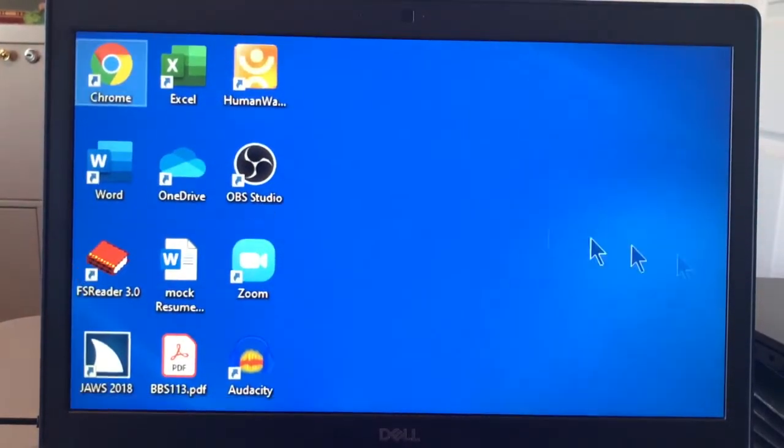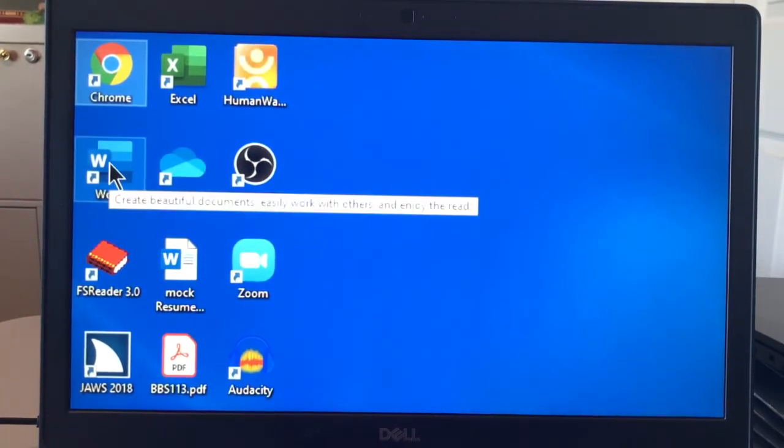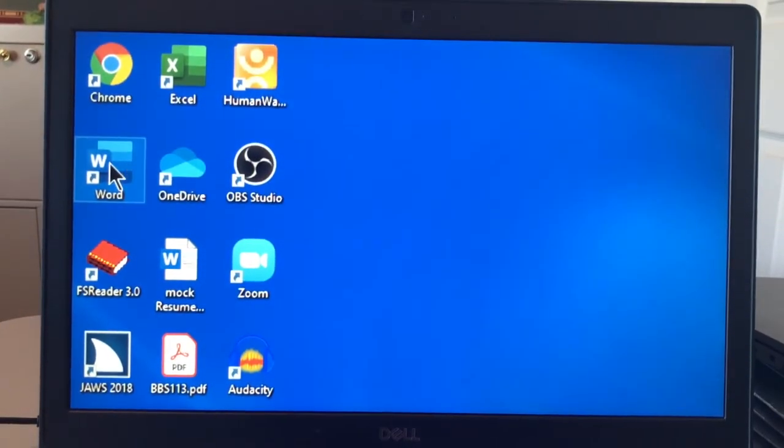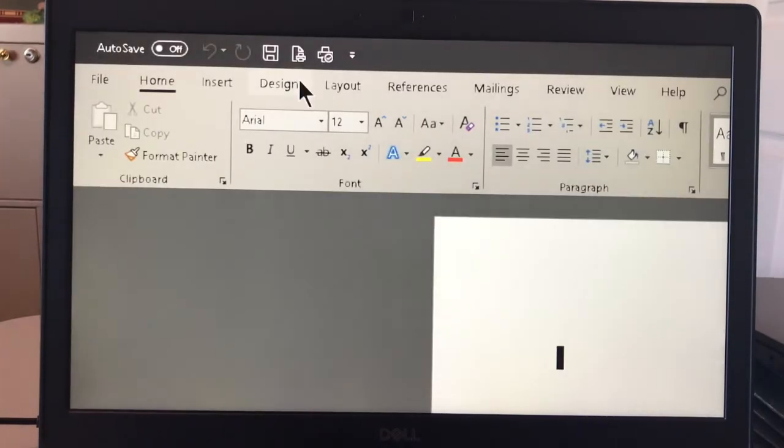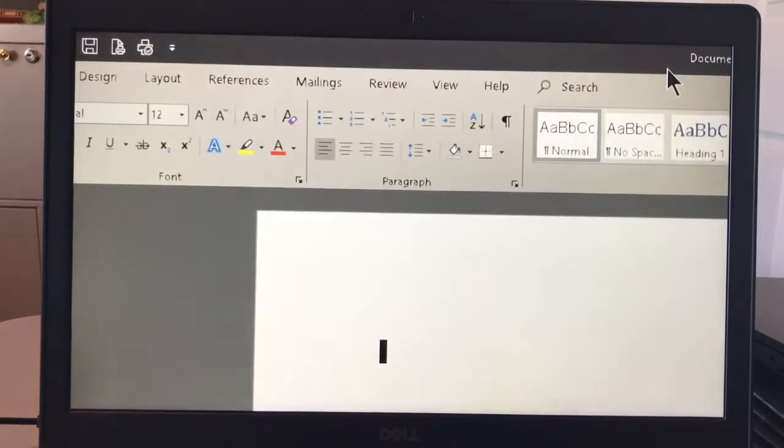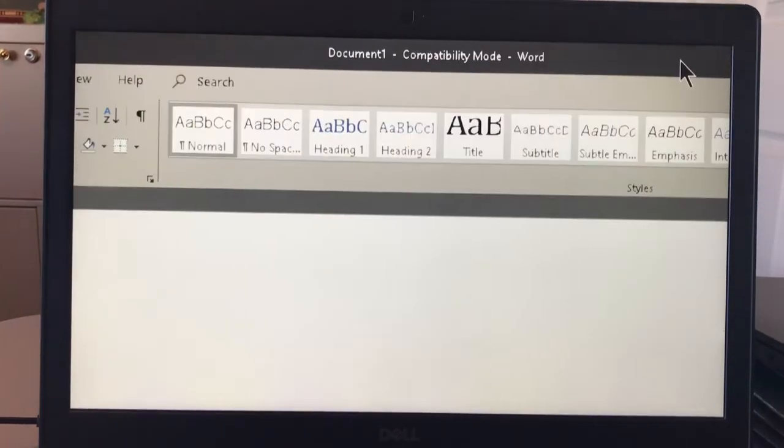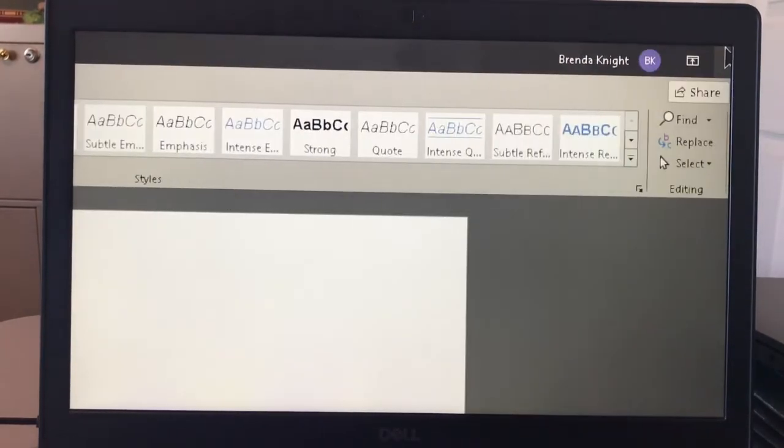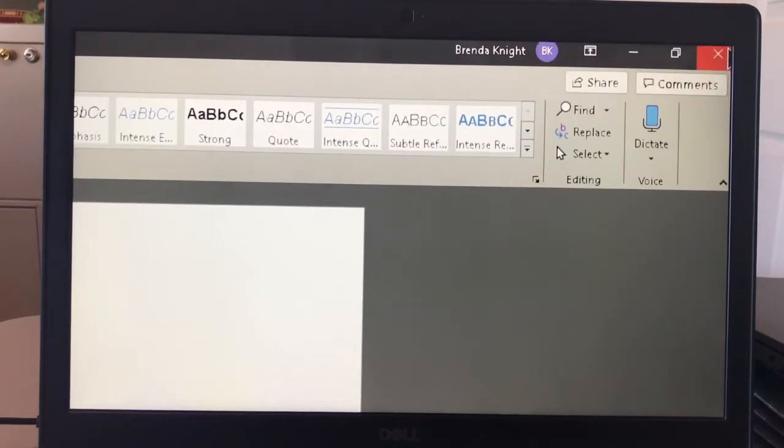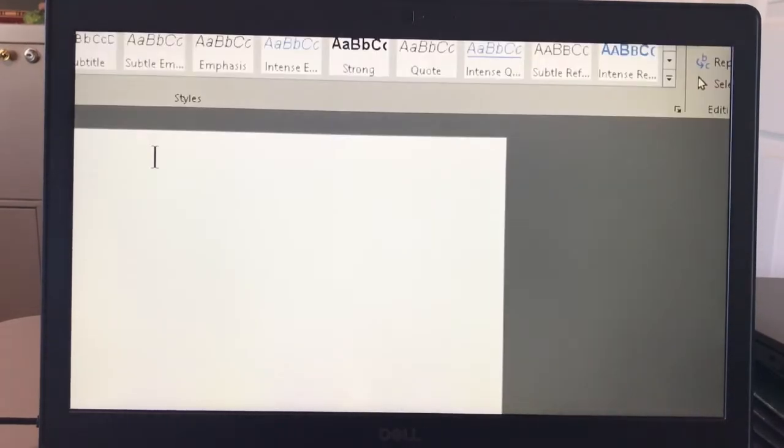Also another thing to show you is the focus will follow the text when you're typing text. This is my word. There's the ribbons. Everything is larger. If I wanted to close it, I'd move my mouse clear to the right side to find that X to close it.